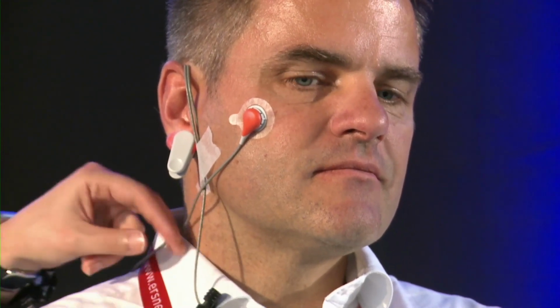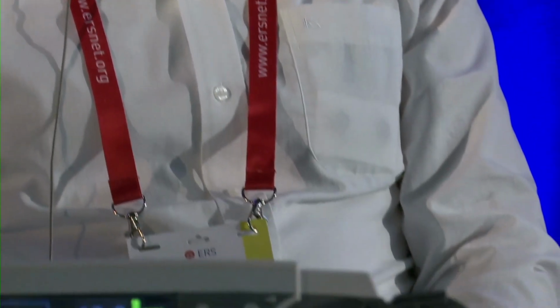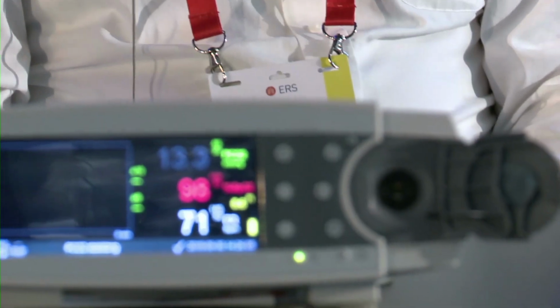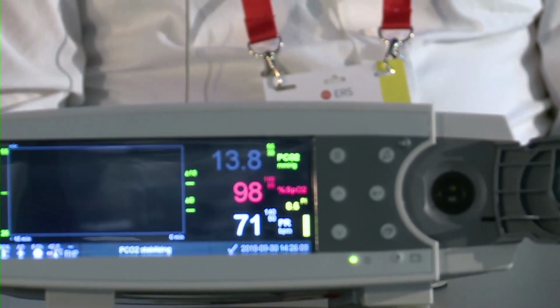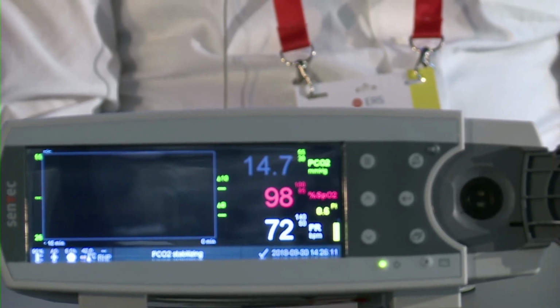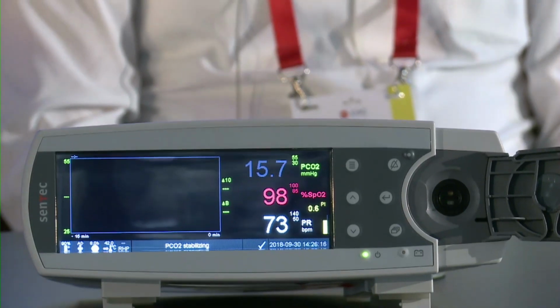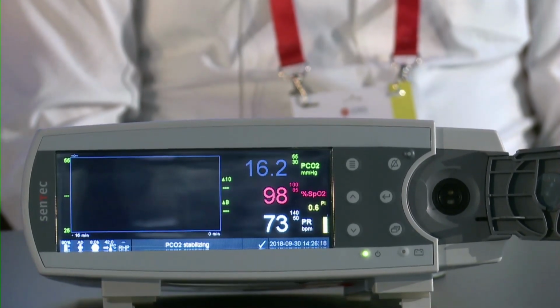Thank you, Chelsea. If we now have a closer look at our monitor, we can see that there is already an SpO2 measurement and a pulse rate measurement, but CO2 is not yet stable. We can see a gray number, and we also see the message at the bottom that CO2 is stabilizing.